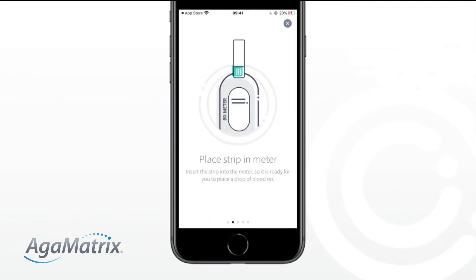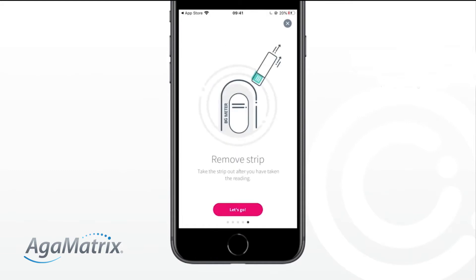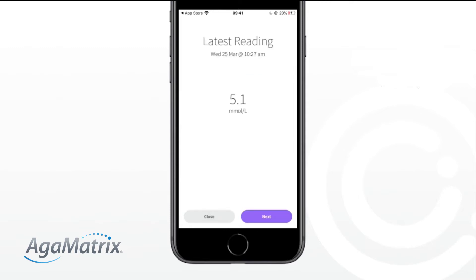The very first time you do this, you will need to swipe through some instructions. Press and release the button on your meter and tap Scan on your app. Make sure your device and meter are close to each other. Any new blood glucose readings will sync across to your GDM Health app.